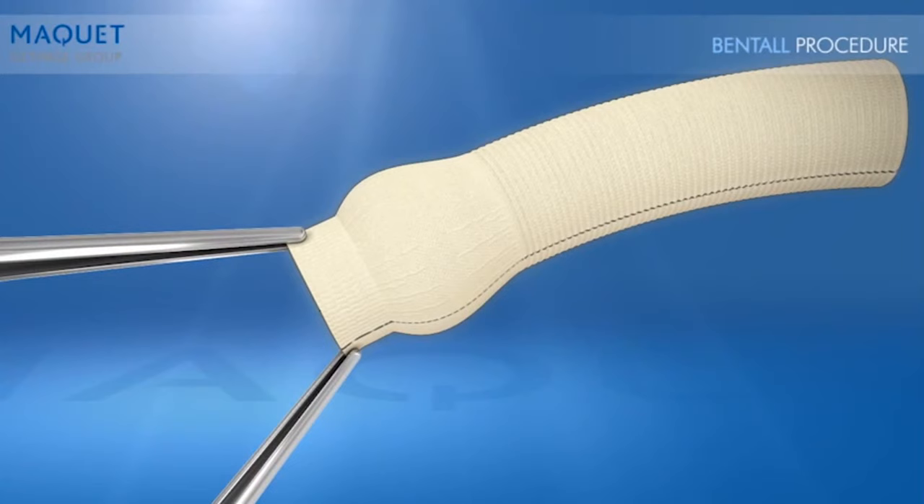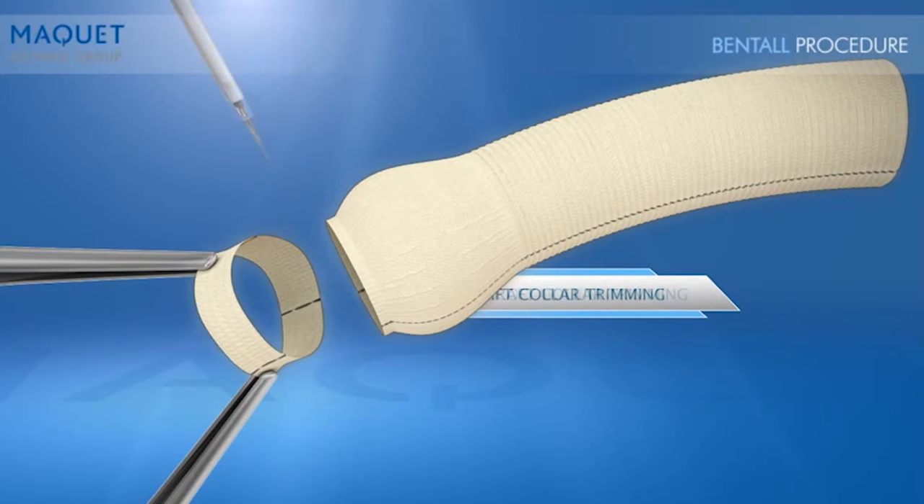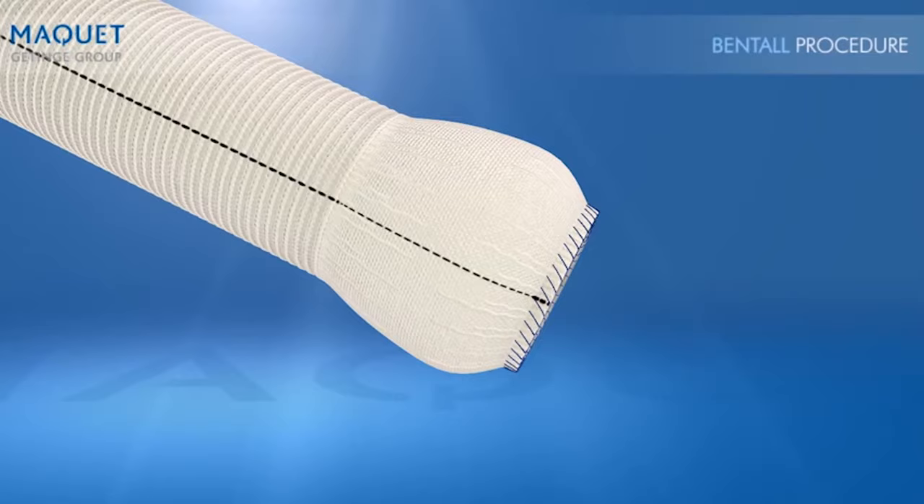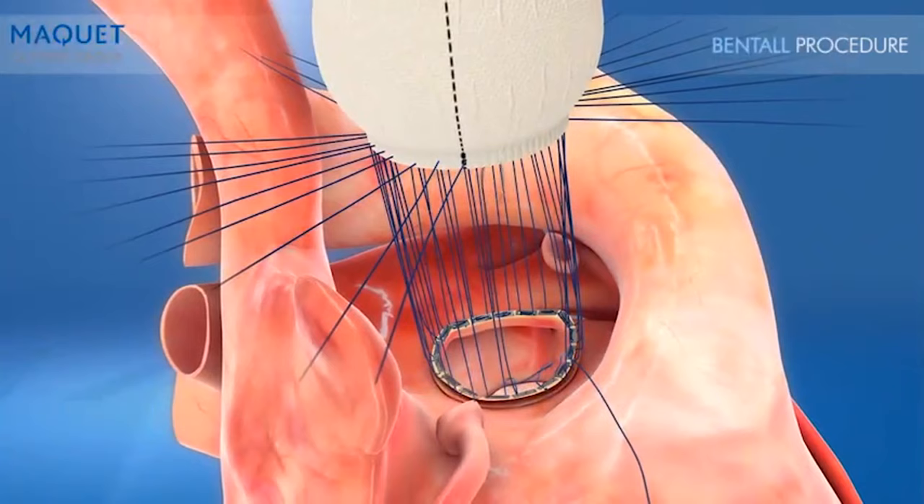The proximal collar of the CardioRoute is uncrimped and easy to handle, allowing for faster and more accurate trimming. When placing the BioValve inside the CardioRoute graft, the unique shape of its proximal end facilitates estimation of the length required for optimal placement of the BioValve. Once the sutures are passed below the annulus, they are then passed through the valve cuff and CardioRoute, securing them together.